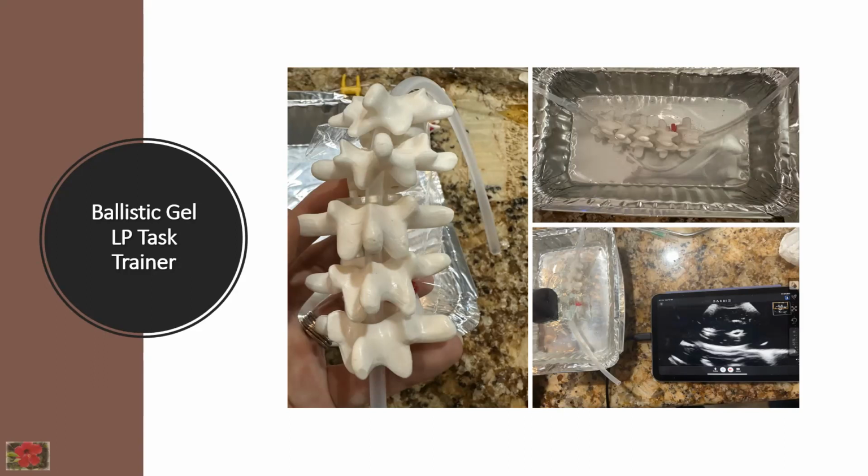So you place the metal skewer and take it off and introduce the tubing in the place of the metal skewer for an IV line? No, those would be for different materials. The metal skewer would definitely be thinner. I would put the metal skewer in and then just remove that.